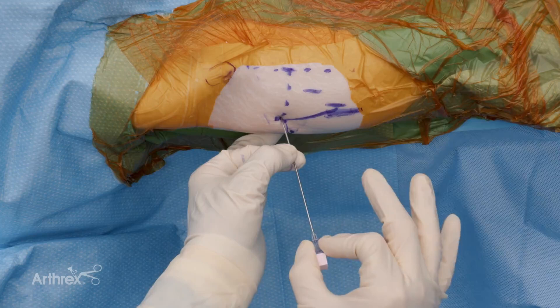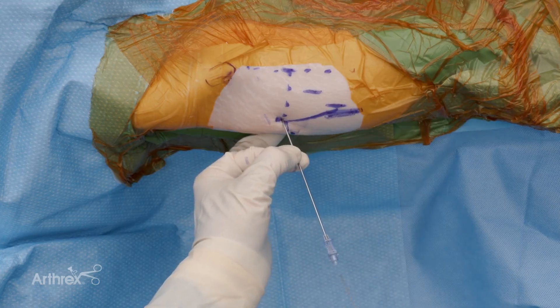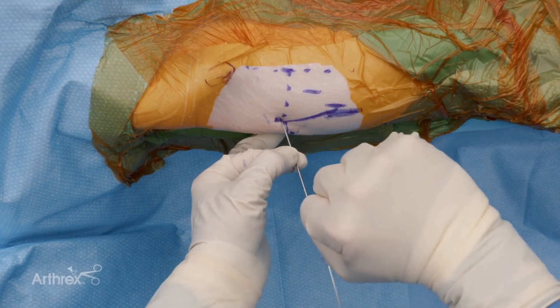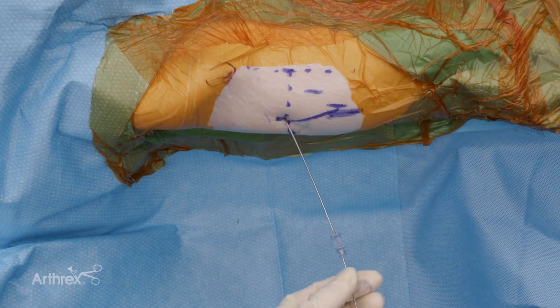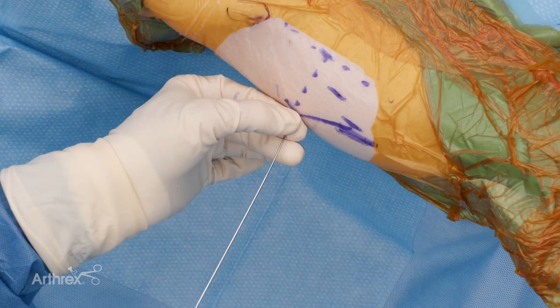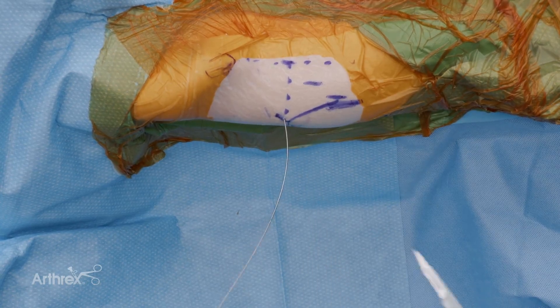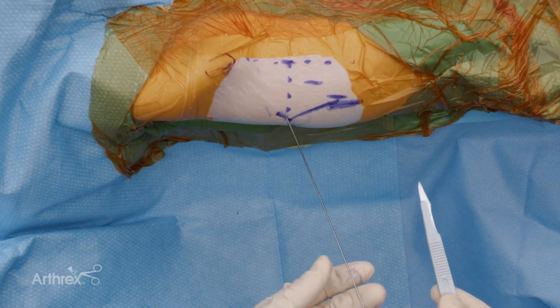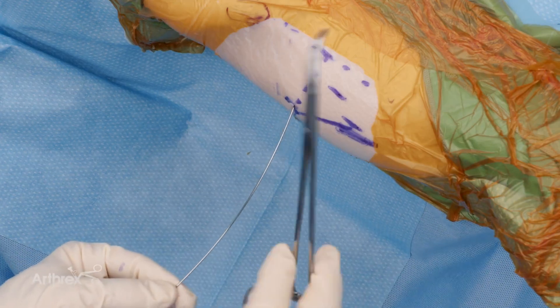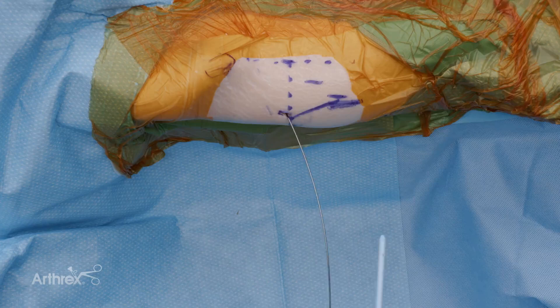The first move is to go down from the skin through the capsule, penetrating that capsule but not plunging deep within the field. We remove the central needle obturator and then place the nitinol wire with two-finger care so we don't cause damage — we want to grip and press that in carefully. Holding the needle and wire, we use what's called the Seldinger technique, very typical for making central lines in the intensive care unit. Next, we take an 11 blade, move the nitinol wire safely without plunging it into the hip joint, and make a linear cut around the wire. We then spread with a hemostat or Kelly to ensure free access down to the level of the deep iliotibial band.